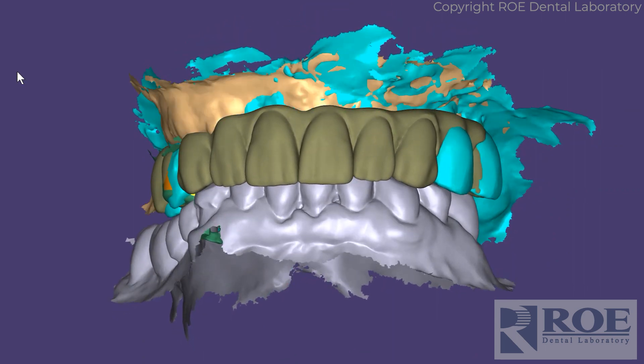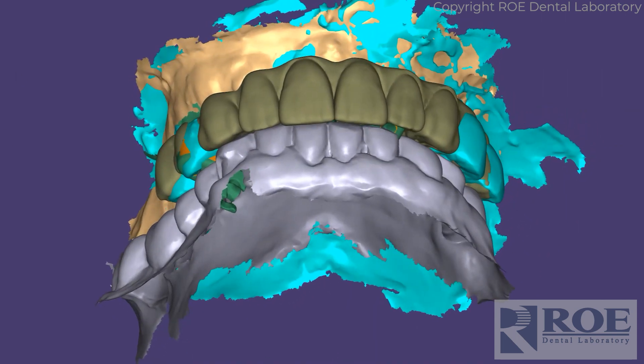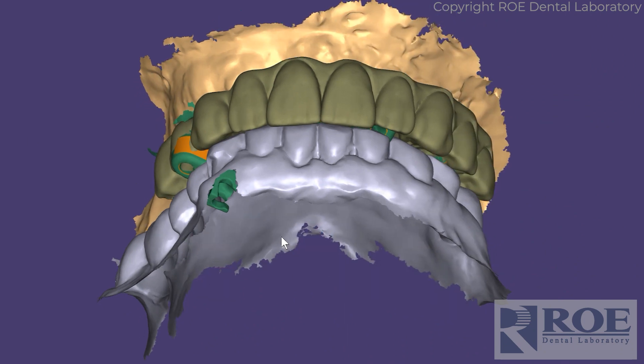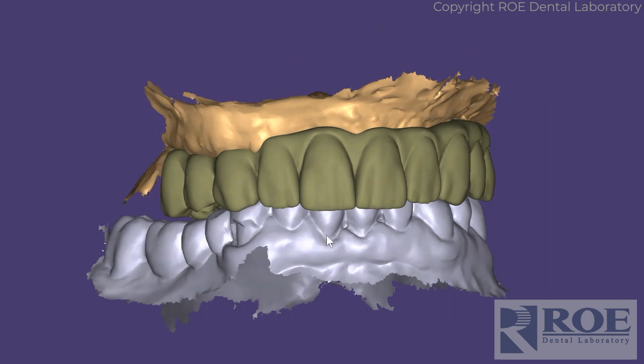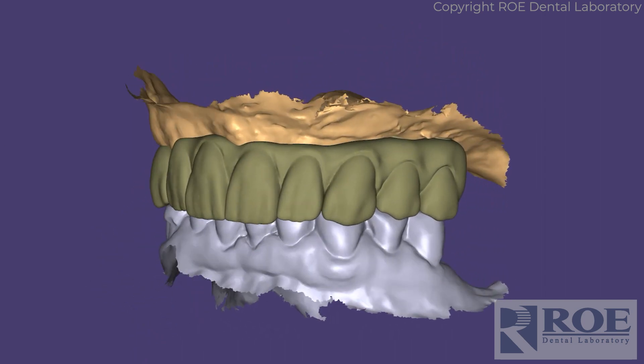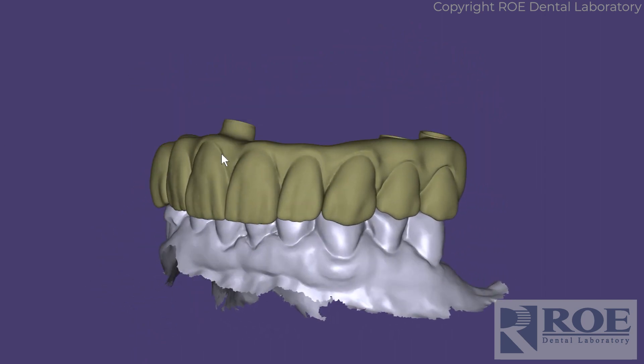Let me show the tissue scan there and turn off the study model. Turn off the OptiSplint — and that is the prosthesis that we made very quickly. I'll show you the intaglio.